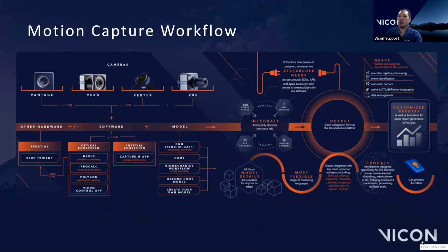So what is the motion capture workflow? Last week, you heard a really good presentation from Derek and Mark about unleashing more flexibility, more power, potentially better quality data from your Vantage cameras. And that fits in right at the beginning, right? So that's going to be the avenue for which you actually obtain your data.